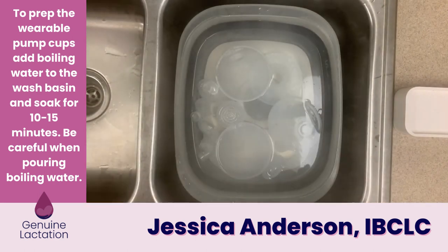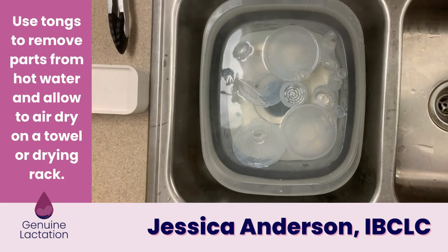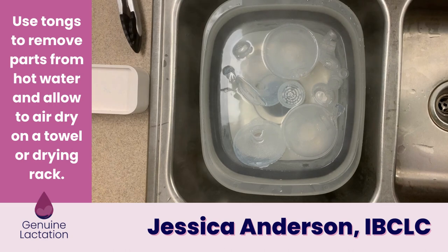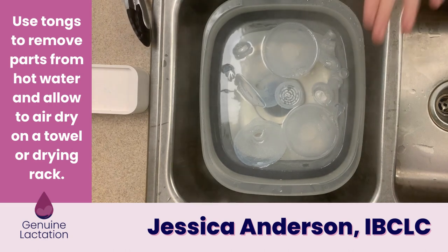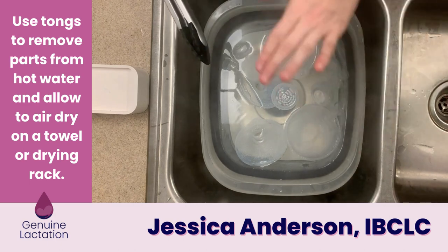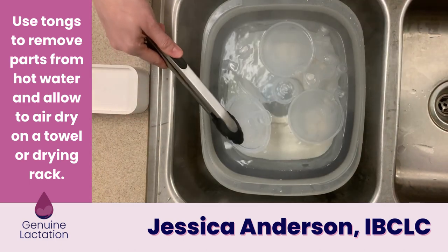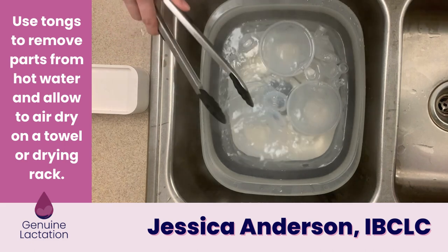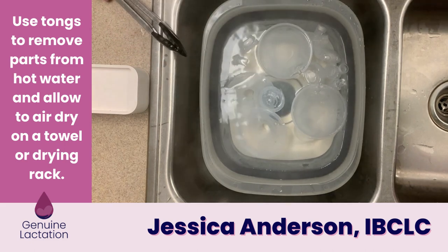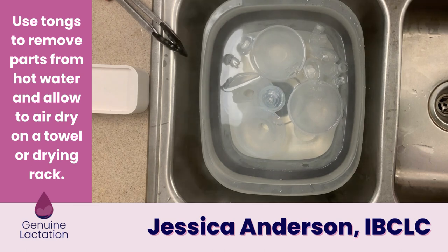You're just going to let them sit in the basin for about 10 to 15 minutes. Once they've soaked, you can trust that they are sanitized. The water is still hot and steaming, so use tongs to pull the parts out and place them on a drying rack or a clean towel on the counter, and let them air dry.